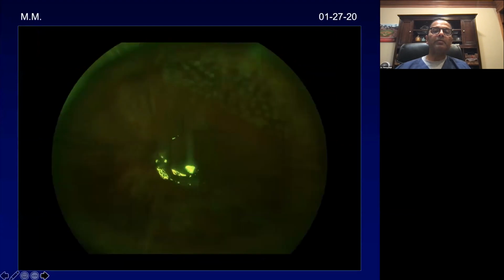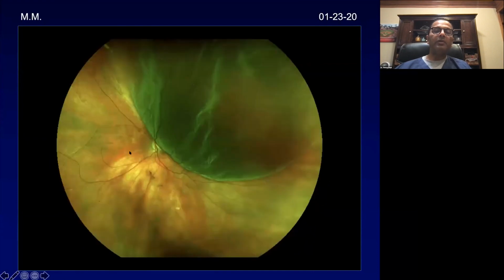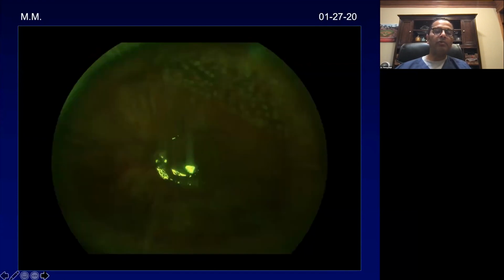Here are some intraoperative photographs of patients having a depressed examination, which I think is really important when we do a vitrectomy in these patients. One thing I like to do is this: post-op day 1, you can actually get a photograph. So here's a patient who had a retinal detachment, post-op day 1.